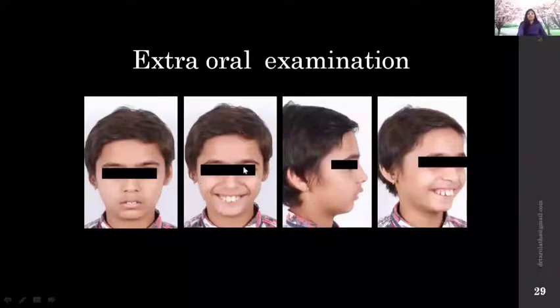Going ahead in the smile, if I check out the smile, I see negative corridor areas here. This is called a buccal corridor area. If you see blackness over here, it is called a negative space, which is not a good sign for a good smile. And when you see the lateral profile, what you see from nasion to subnasal, subnasal to pogonion shows that the mandible is quite retruded.